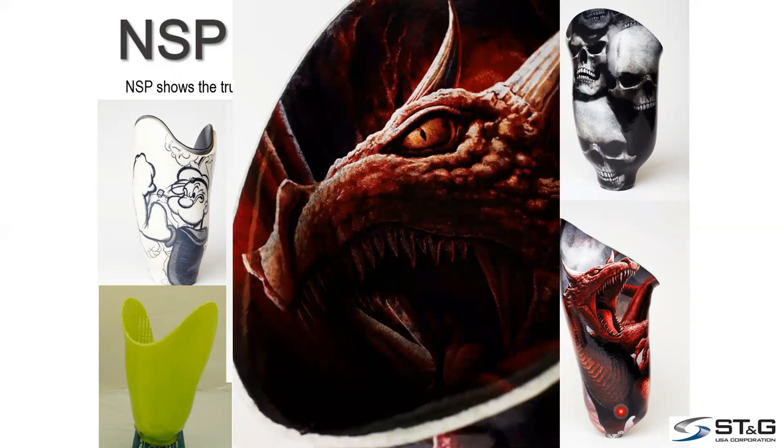And this socket in particular has a transfer on the inside. And it's really neat, because if you've seen the socket, it has a 3D effect, because it's on the inside. And when you turn the socket, it just really pops out at you.